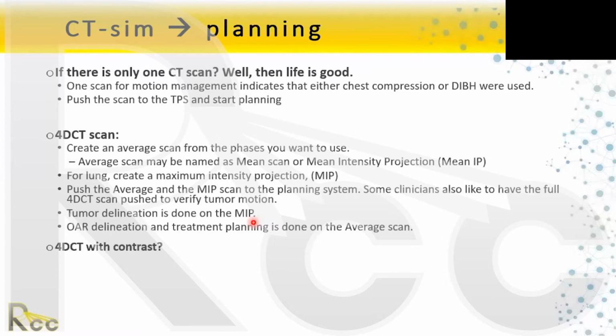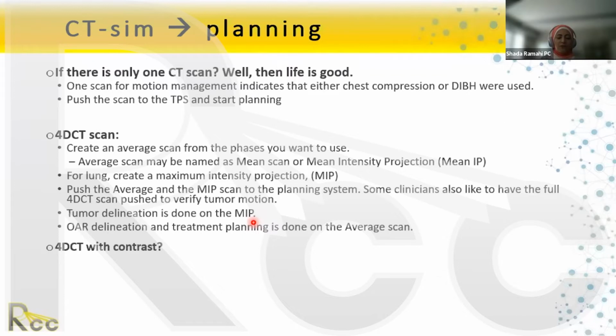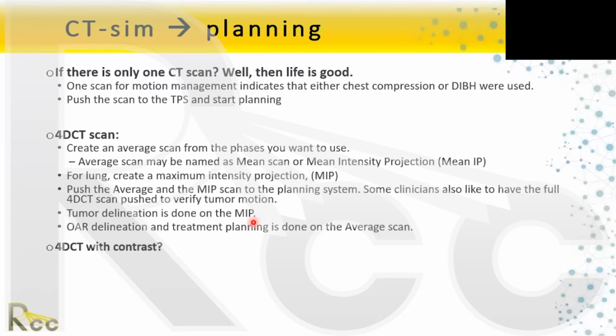Yes. So you just use a 4D CT scan to verify that your compression is good. And if the compression is not adequate, then you might need to use the 4D CT scan for your contouring and figuring out what ITV to use.